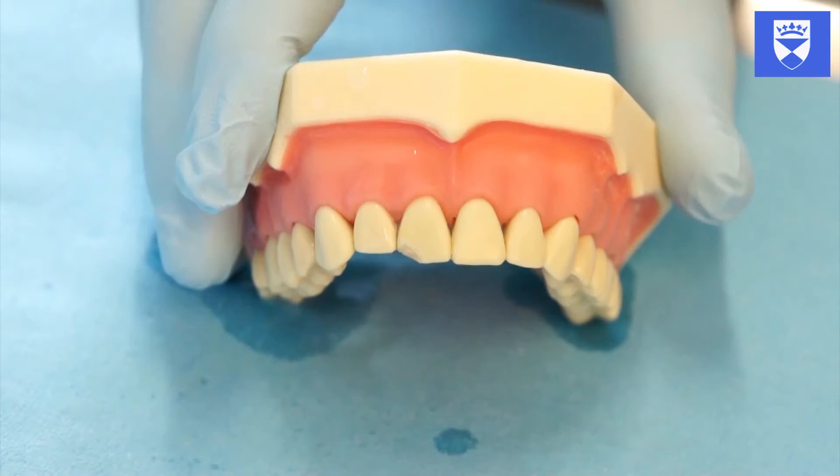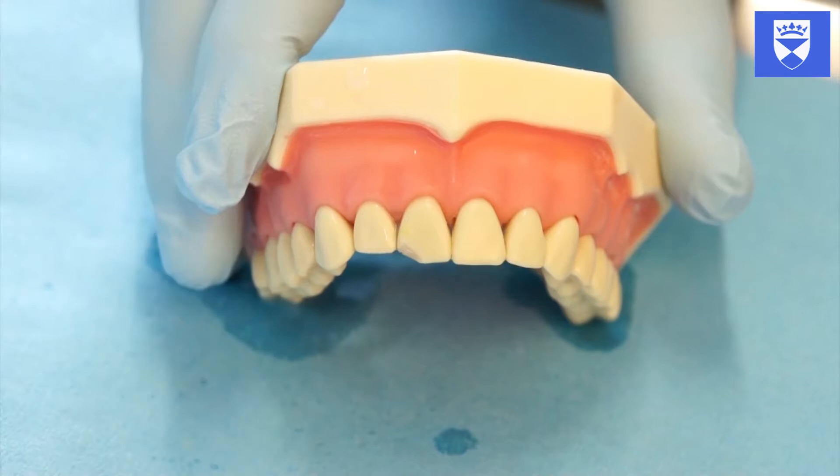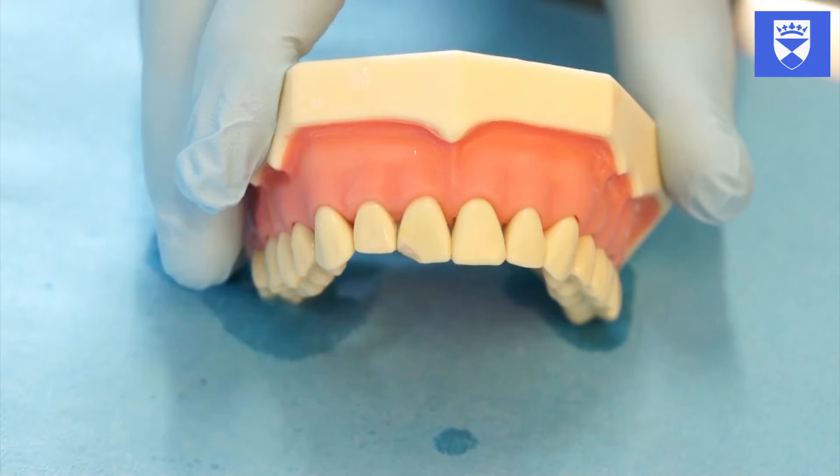It is important to take note of what has been undertaken prior to this visit. If there has simply been an enamel dentine fracture then the majority of the composite bandage can be removed. If the tooth has experienced a pulpal exposure and has previously undergone any pulp capping procedures, it is imperative that we conserve the composite overlying this. Excessive removal of composite may result in a further pulpal exposure and greatly diminish the long-term prognosis of pulpal vitality.